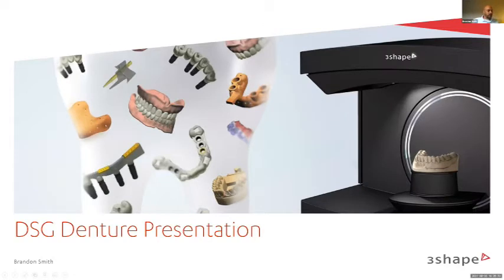And the case that I went ahead and did is what I call a reference denture. So it's basically taking a denture that the patient is already wearing and doing a wash impression inside of it and then scanning that. You can also take a bite in between the dentures. You can scan all that. You don't have to scan that in the patient's mouth. You can scan it in hand. And then taking that into our dental system software and designing a denture around it.